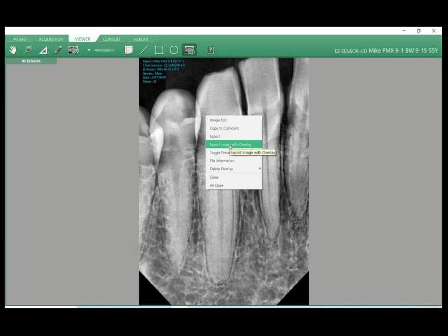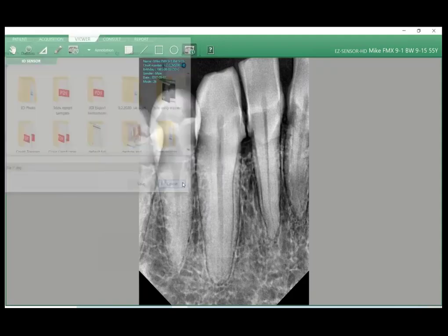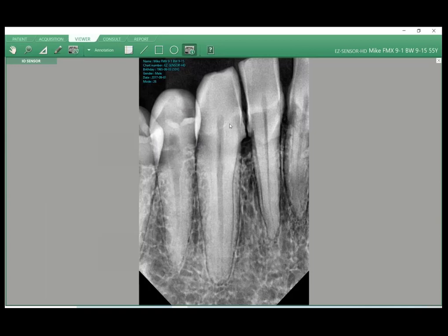I did want to report, show that. Yeah, good tip there. Okay.